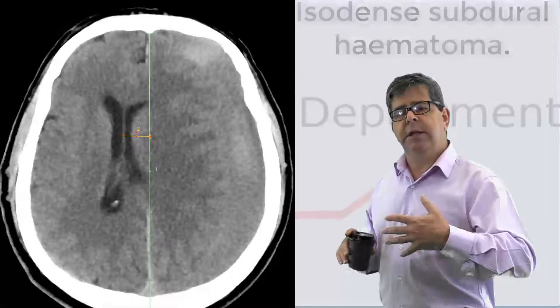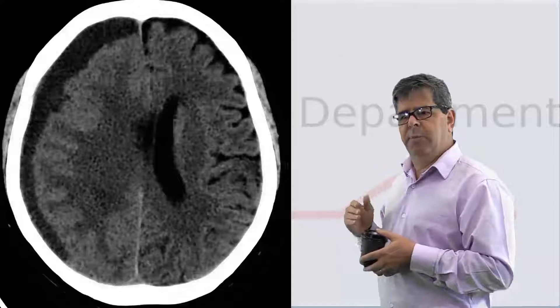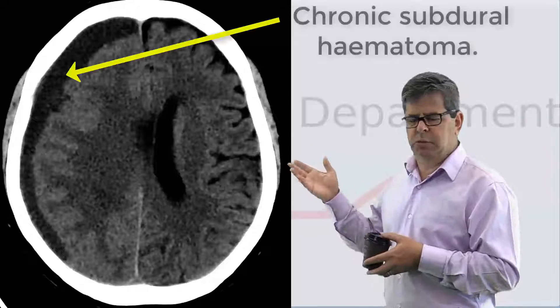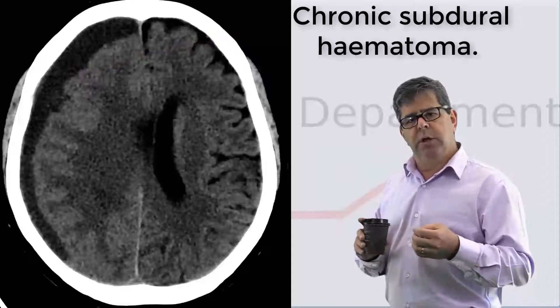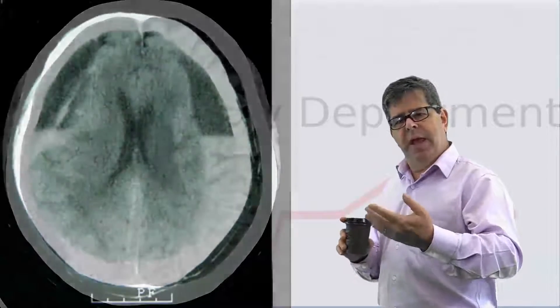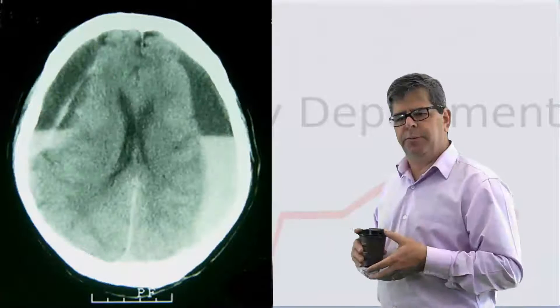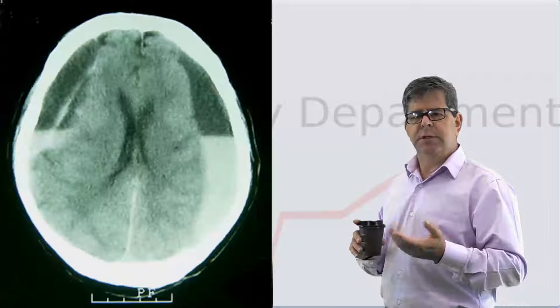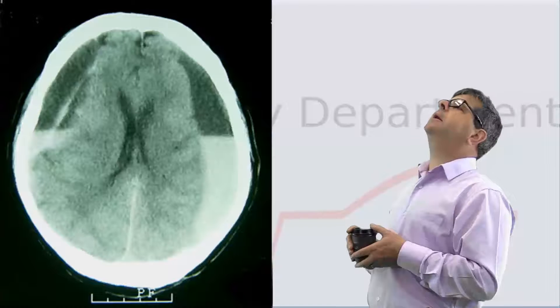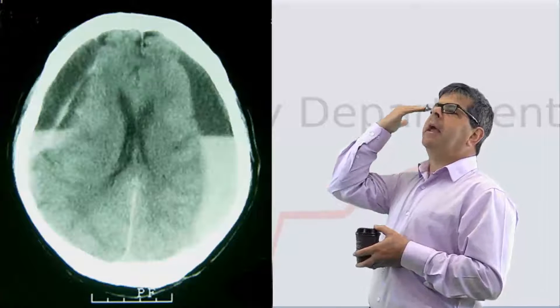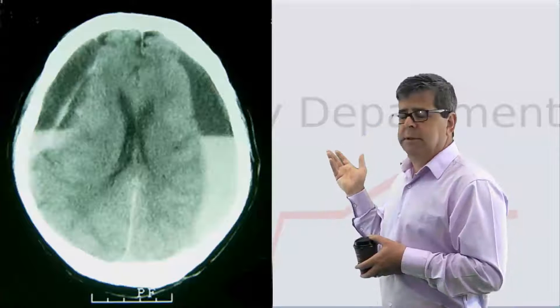If they present even later, they could have all that blood broken down and have the appearance of a chronic subdural, bilateral or unilateral. The last scenario is where you have a chronic subdural and then bleed on top of that — an acute bleed on top of chronic subdural. Sometimes you get a quite unusual appearance where, because the patient has been lying on their back in the CT, the heavier new blood is layered out, as you can see here.